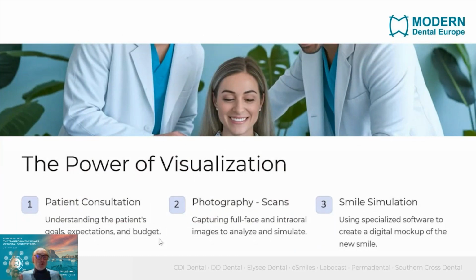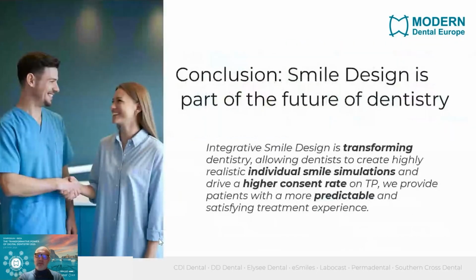So actually the whole story, everything we have been discussing up to now is about smile design and also actually about visualization. It's about the power of visualization, because we are taking the patient into a visual process where they already see the treatment, see the end result, and try to convince them to consent to the treatment plan, which can sometimes be difficult. But this kind of digital tools, mock-ups of the new smile, can really help us to get there.